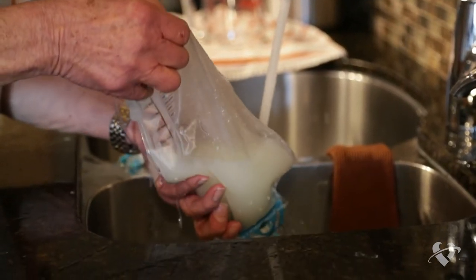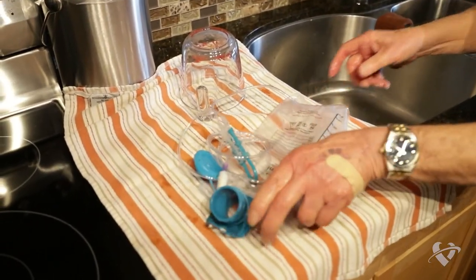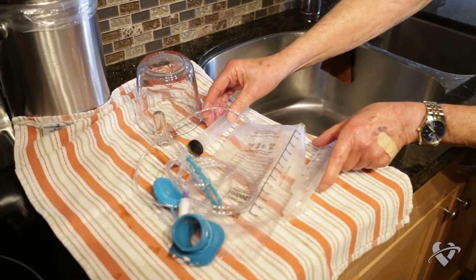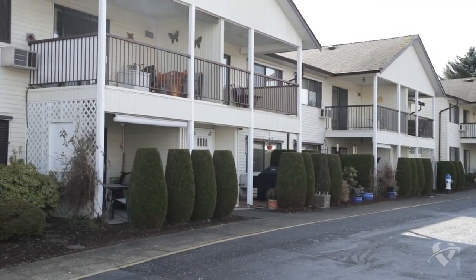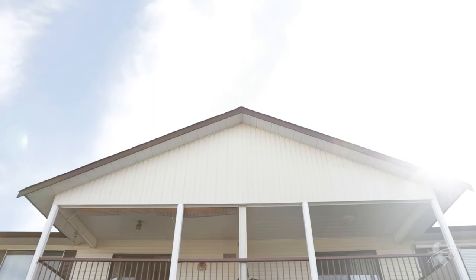Your feeding is now complete. All that is left to do is clean and put away your supplies and remain upright for at least 30 minutes. If you experience any issues with your feeding, contact your dietitian or your doctor.